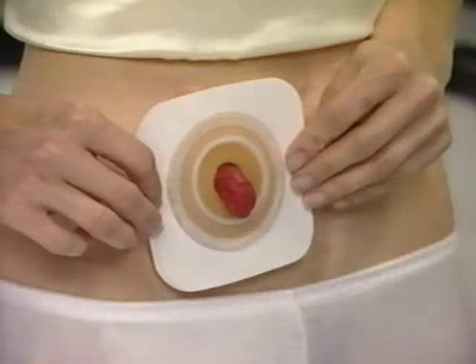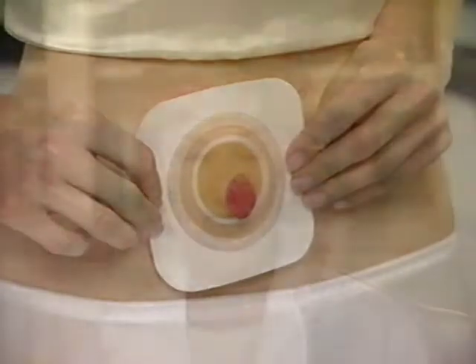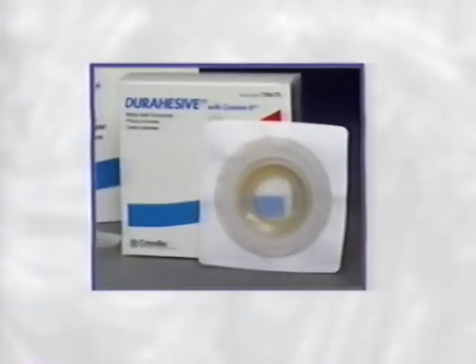Remove the remaining release paper from the tape collar, smoothing it gently outward as you go along. If you're using the SureFit Nutura system with a Durahesive skin barrier, it will slowly swell around the stoma in what you might call a turtleneck effect. This is completely normal and will not block stool or urine flow in any way. If you have a flush or retracted stoma, you may need to use one of the convex products to increase wearing time and comfort. Please contact your healthcare professional or Convatec Professional Services to learn more about these options.